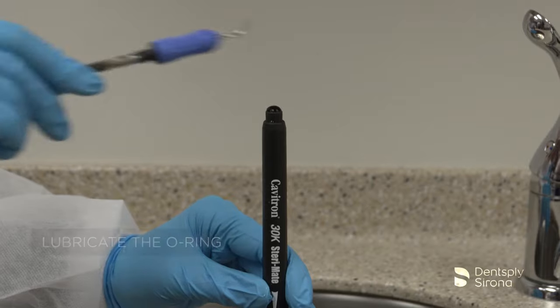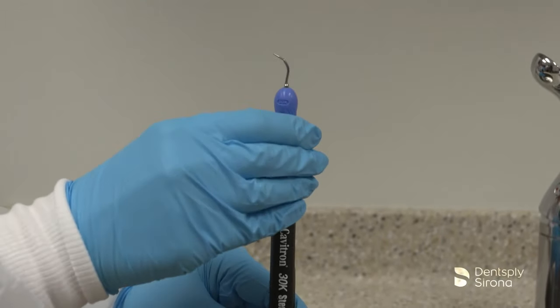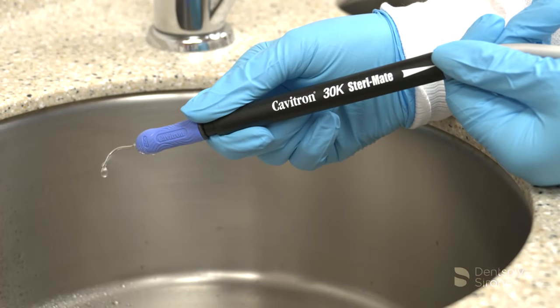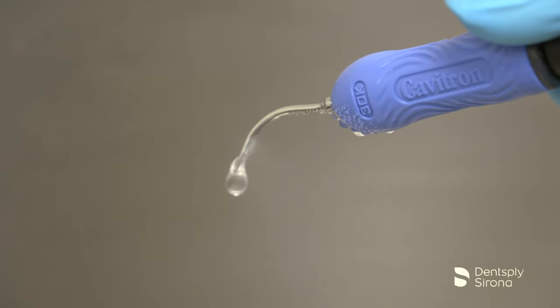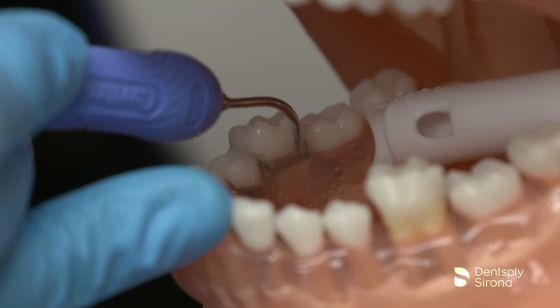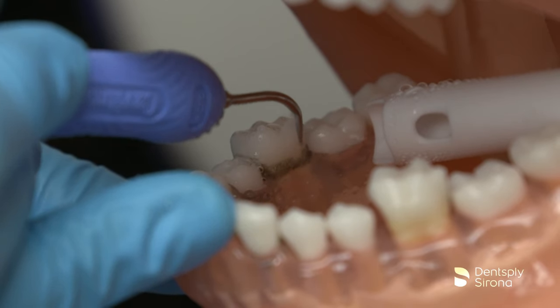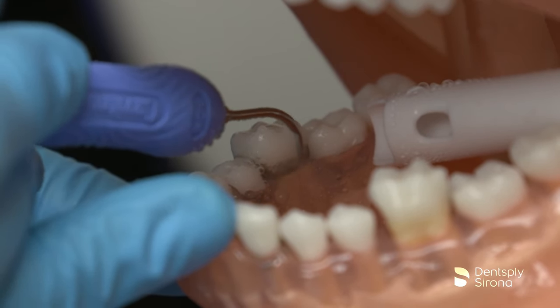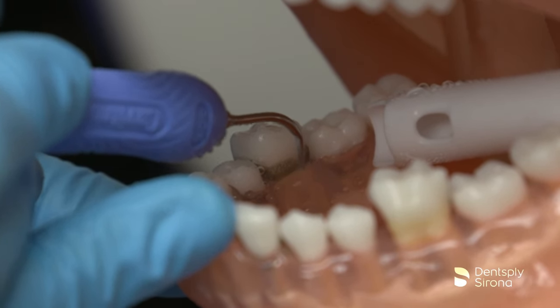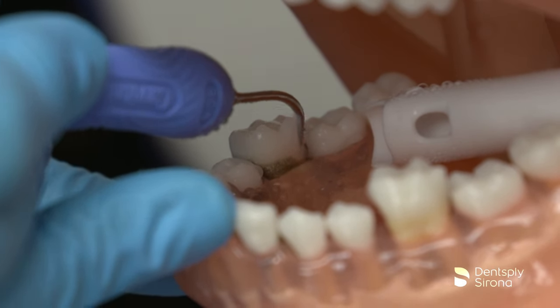After the clinician has filled the handpiece with water, seated the insert, selected the power, and adjusted the spray properly, instrumentation begins according to the treatment plan. The double bend shank of the Cavitron FSI-100 allows the clinician to easily adapt this insert in the posterior region, providing access into deeper pockets of the interproximal spaces where heavier deposits may be encountered.